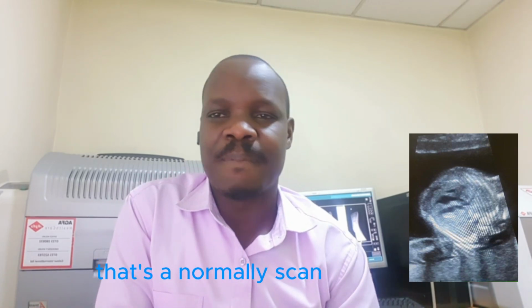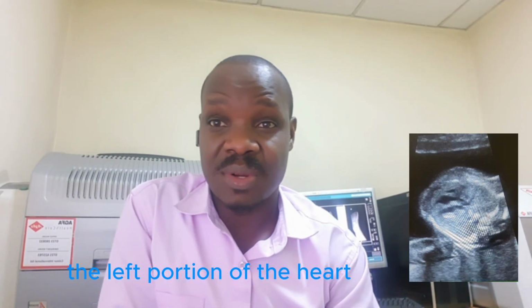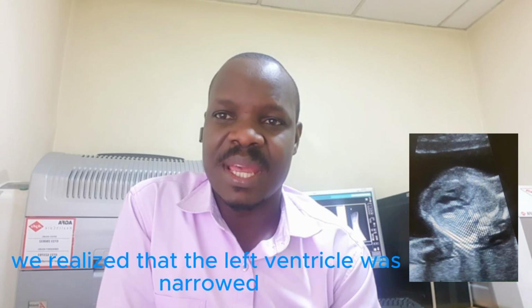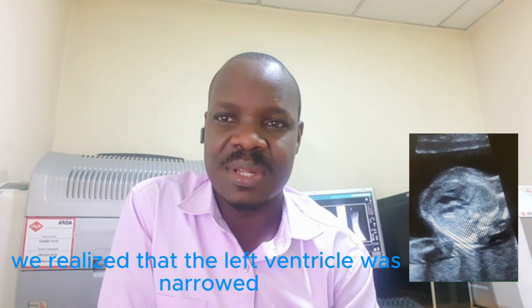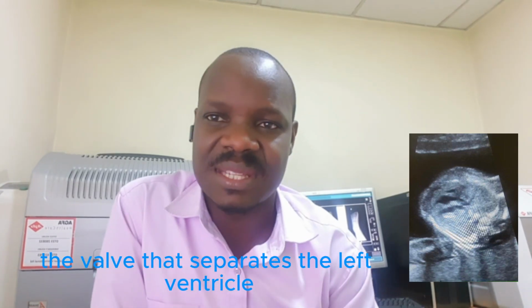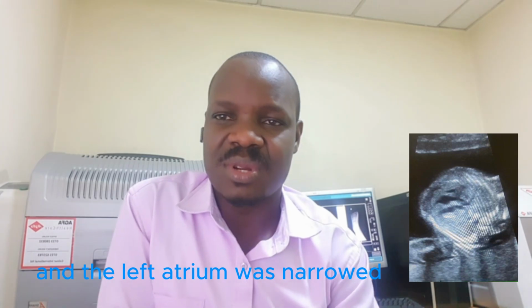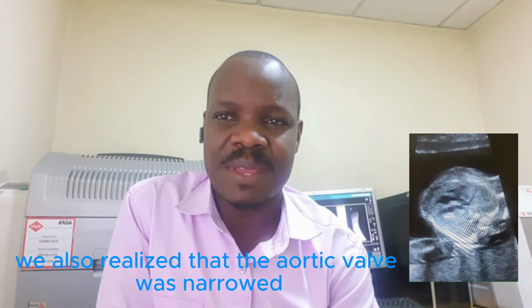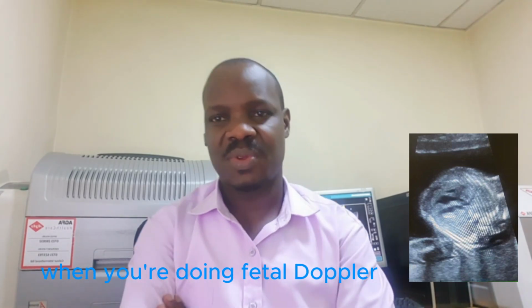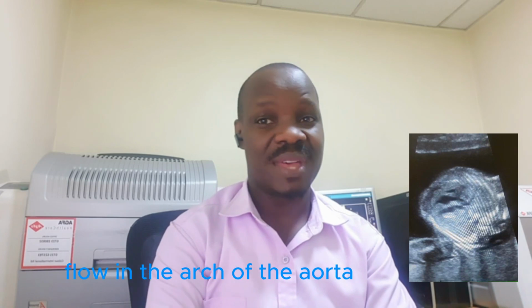That's a normal scan. And on doing a scan, I realized that the left portion of the heart of the baby was not well developed. We realized that the left ventricle was narrowed, the left atrium was narrowed, the left mitral valve, the valve that separates the left ventricle and the left atrium, was narrowed. We also realized that the aortic valve was narrowed and the arch of the aorta was narrowed. When you're doing fetal echo Doppler, we realized that there was a reverse flow in the arch of the aorta.